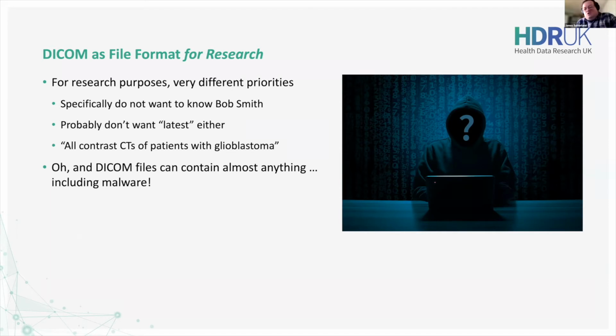Often we aren't interested in the latest scan. Quite often we're interested in the oldest available scan for a particular subject. We have, for example, a dementia study that's looking at longer term prognosis and progression of disease. They are specifically trying to find the oldest possible MRI for each patient, and then looking for any early warning signs and how the disease might have progressed even before it was diagnosed and detected, if there were early warning signs that could, with hindsight, have been picked up on.